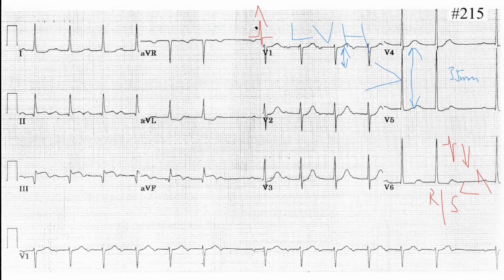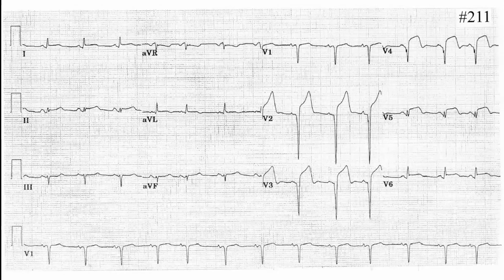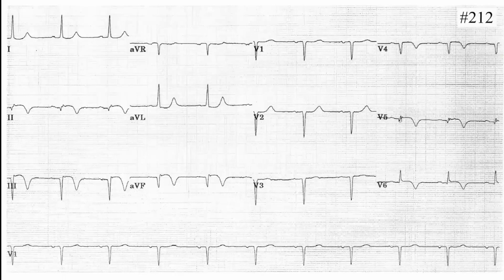Okay, thank you so much. Watch the nice movie about hypertrophies and examples as well. All right, good. Now let's see the following one. I think we discussed this one and we have not discussed this. Okay, now who is the next one?